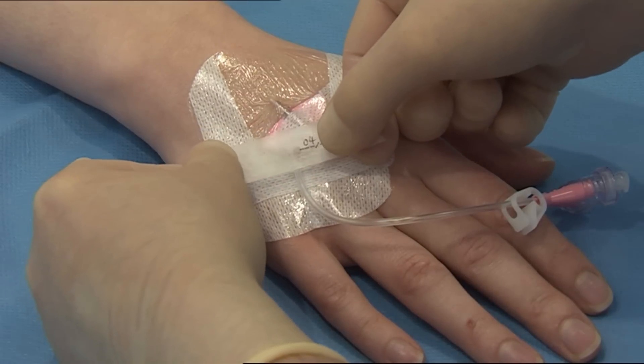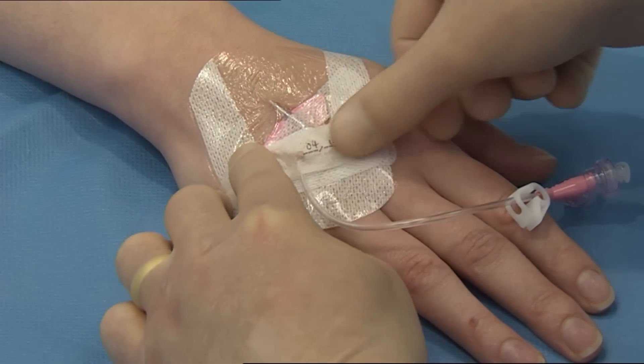Date the recording label and place across the dressing for documenting dressing change.